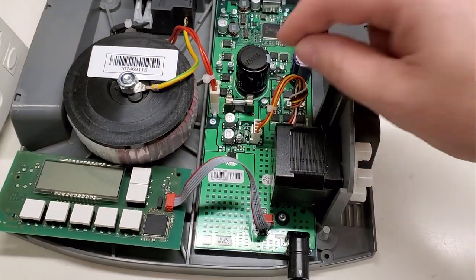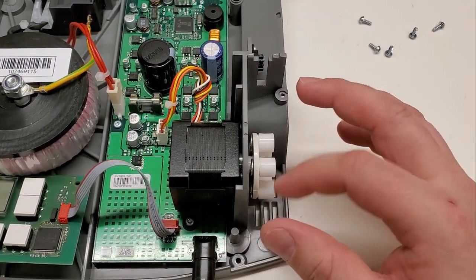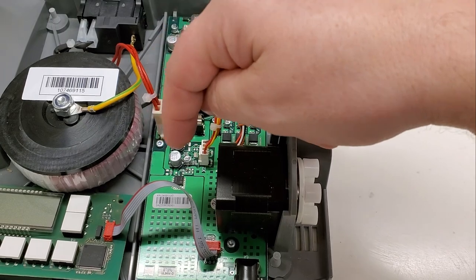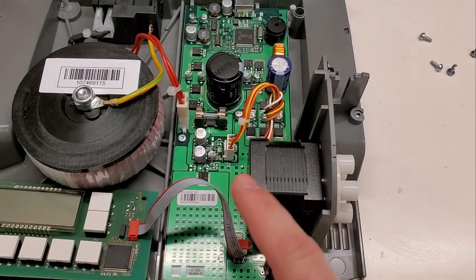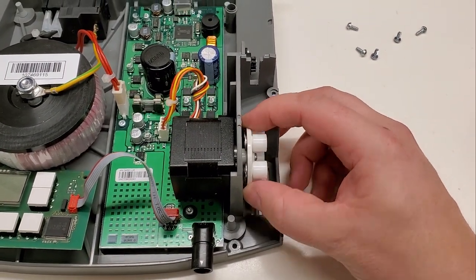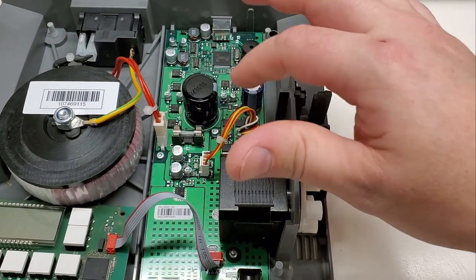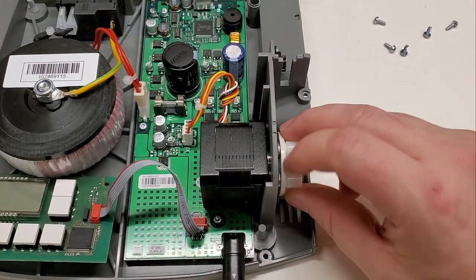Now there's multiple ways of testing a stepper motor. Stepper motors are very stupid. They don't check their speed. They don't care what their speed is. It's just one direction. The pulses come to the motor and that's it. There's no feedback, which tells you, let's say that you have an occlusion on your tubing or there's a jam here at the pump. There's no input that maybe with current, you might be able to do it with current. You know, current overload says now we have a problem with the motor.